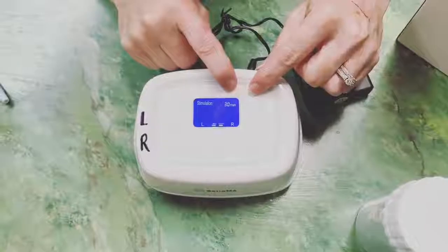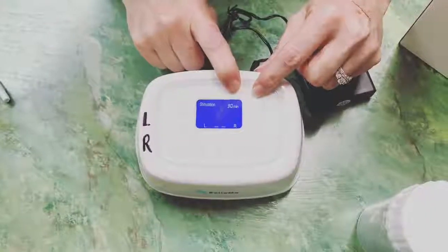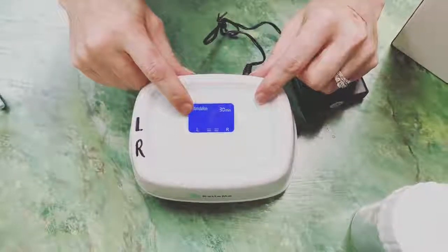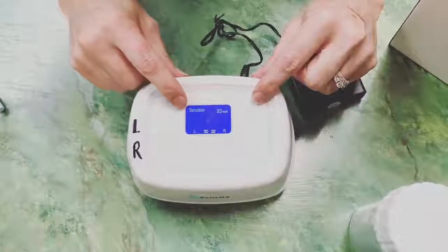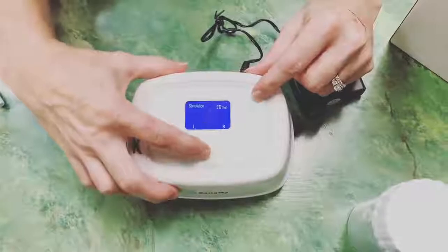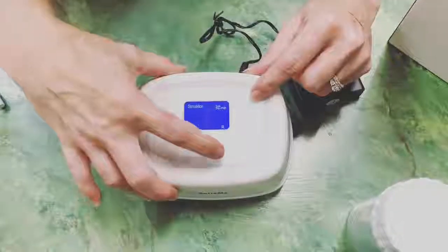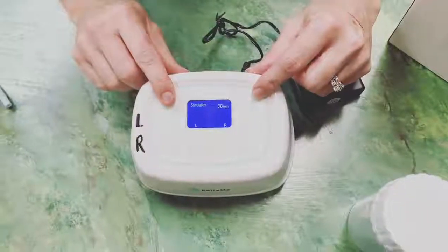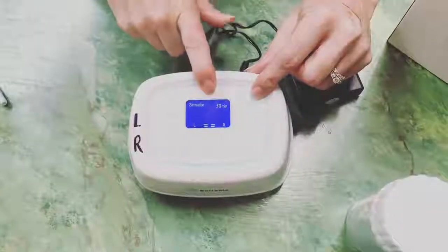You have a built-in 30-minute timer so that you don't overpump and you still have enough milk to feed baby later. Your stimulation mode starts out in level 2, and it can go up to level 3 here in just a minute. There it goes. This is just the basic letdown phase. If you need a higher compression of the letdown phase to get your milk in, just up your pressure setting. At any time you can reduce it down. We always remind you to manual massage your breast if you need help getting your milk to come in. This phase stays on for 2 minutes.